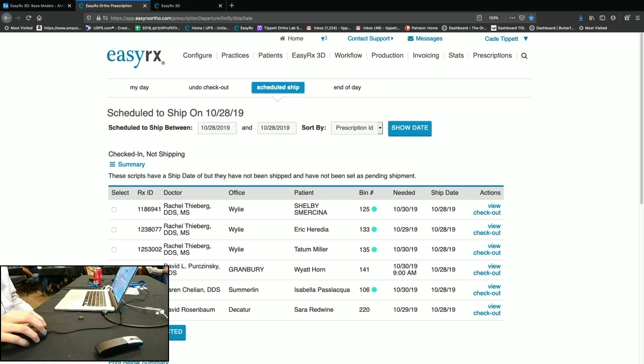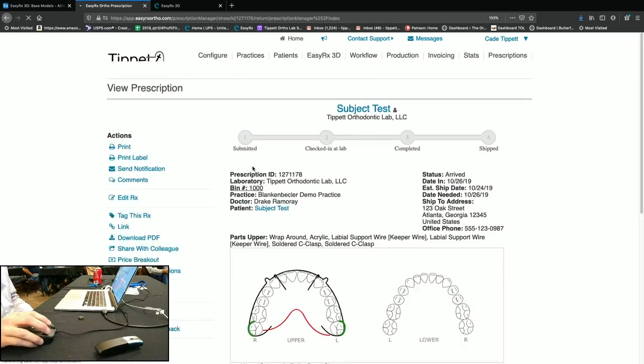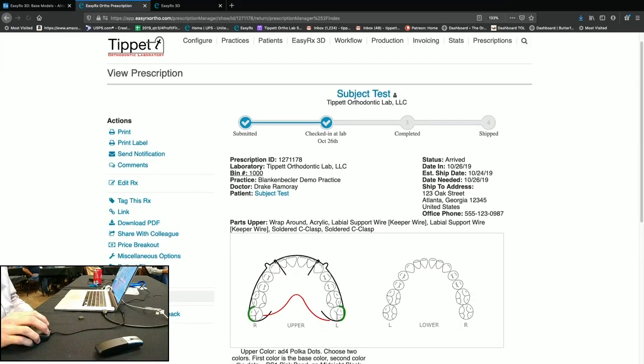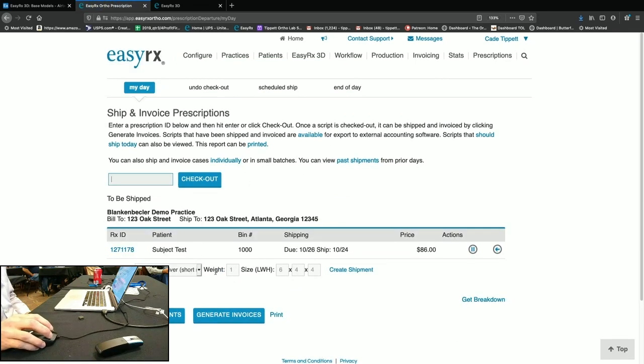And I can check out the select it from here. And then it goes into, I'm going to check out that one, Drake Remore. Let's view it. You can check it out from here. That means you're done with it. It's completed. Now this will show up completed on the doctor's side. So then I can go to check out and it'll show up there.